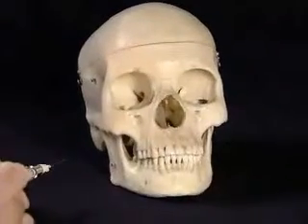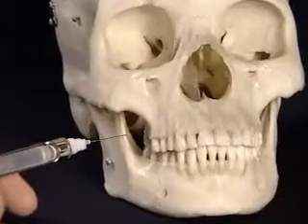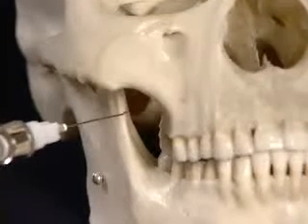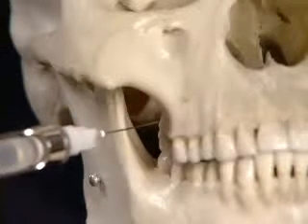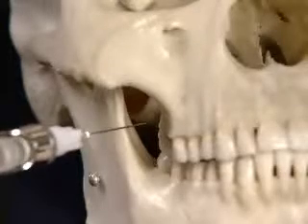It's important to begin by knowing where the anterior border of the ramus is. That should be palpated, and then the coronoid process noted. The coronoid process marks the lateral border of where you would want to insert the needle, and the needle insertion goes between the coronoid process on the lateral and the maxillary tuberosity on the medial, and the point should be selected in between those two sites.